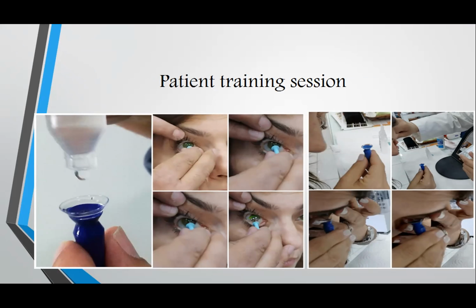And the third part, provide your patient enough chair time to give them the training session in terms of insertion and removal as well. At the end of this cycle, if you achieve it all well, you will be having a great success story in fitting these lenses and patient reality.